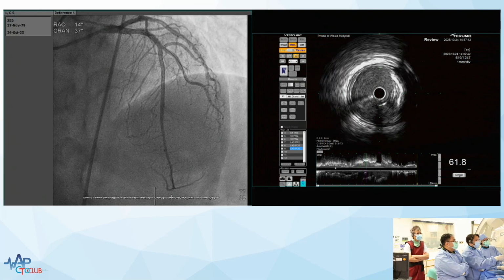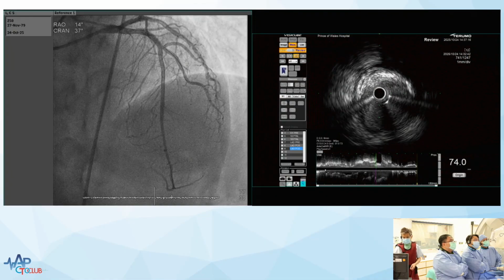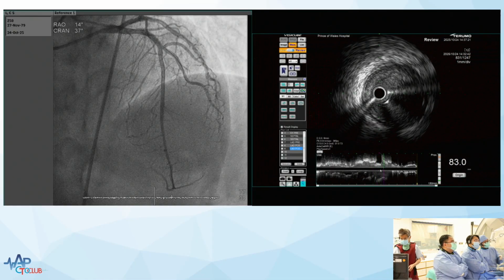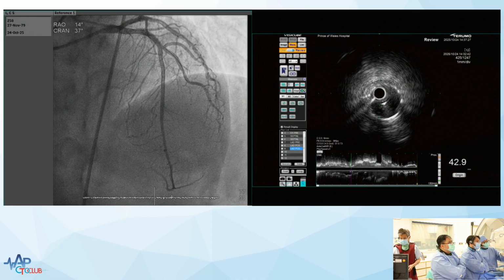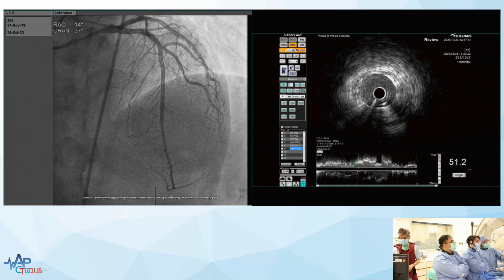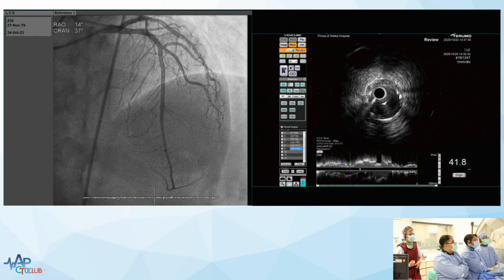So probably we can do 3.5, right? Just below the diagonal. Yeah, we can, to get a better result because it was 3.5 beforehand, right? Yeah, but the reason I stopped here is that I initially wanted to wire the septal before we do the 3.5. But if we opt for not doing the septal, then we can just post-dilate with 3.5. Yeah, just the proximal bit maybe. Shall we? We just go for 3.5. Okay.